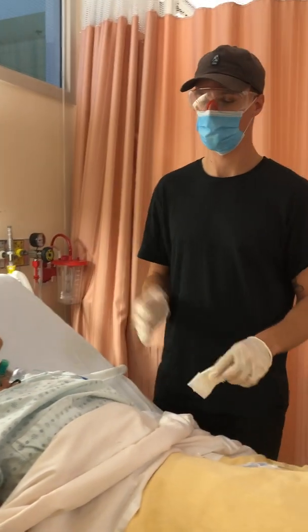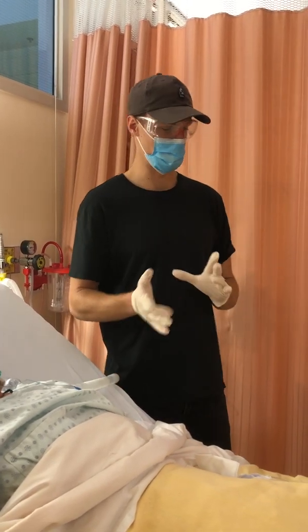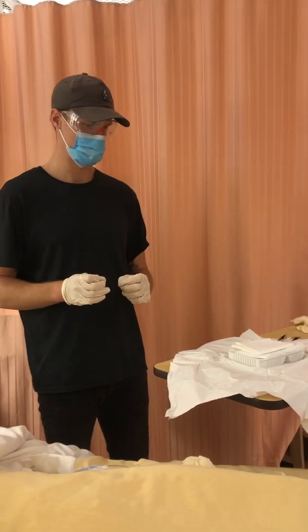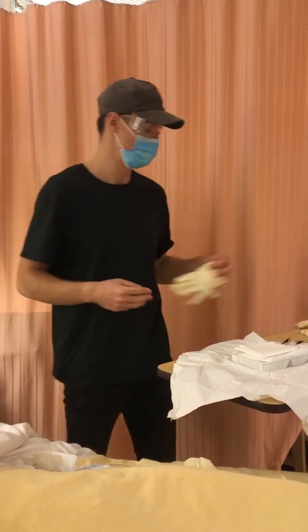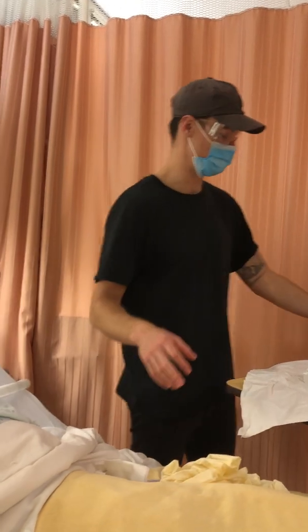And then I would take the old dressing off since I'm here, and then I'd assess it. I'd see that there's some drainage. Other than that, it looks pretty healthy. So now I'm going to go ahead and start cleaning. So I'm going to change these gloves, perform hand hygiene, put on another pair of gloves. Obviously not those, they're used. I would use these.